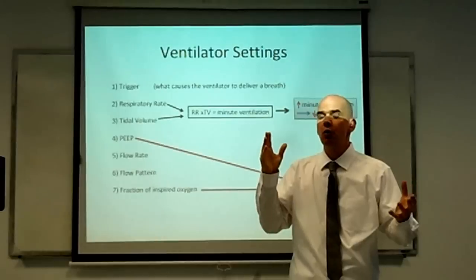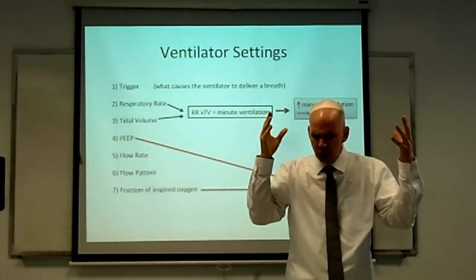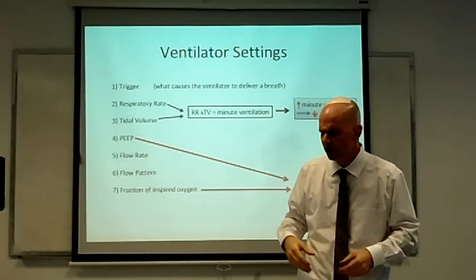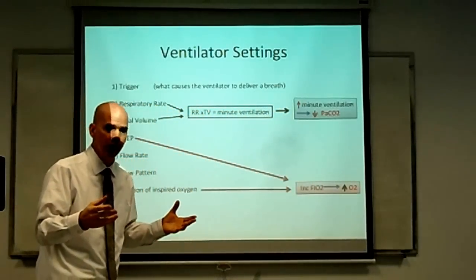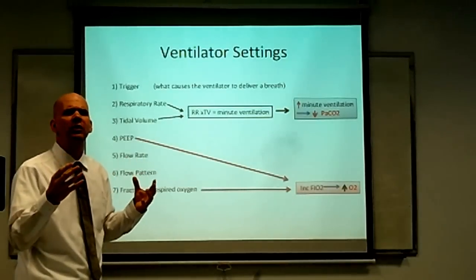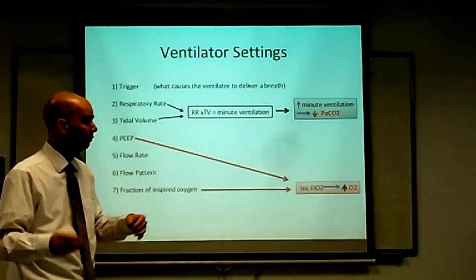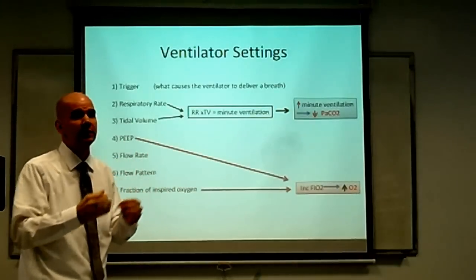So basically, we've discussed how to avoid the monster Charybdis, how to avoid having our patient drown in inadequate gas exchange. Now let's look a little bit more closely at the other monster, Scylla, of ventilator-associated complications. Let's look at how these complications relate to our ventilator settings, and how we can hopefully avoid these complications.